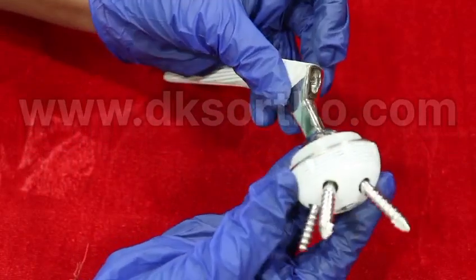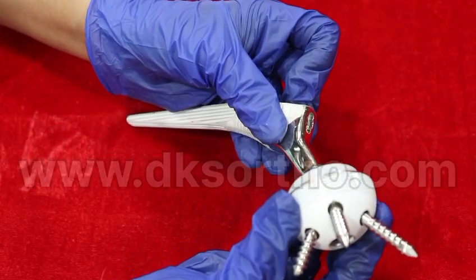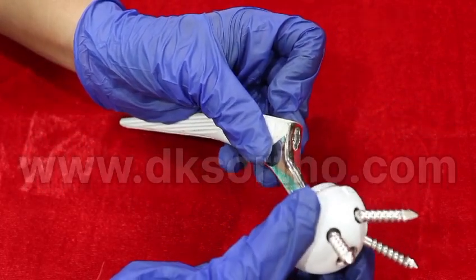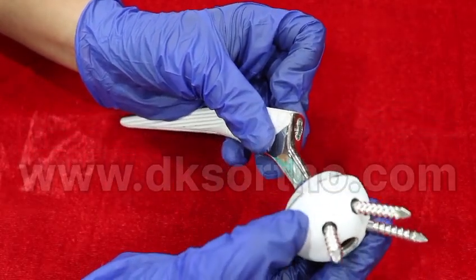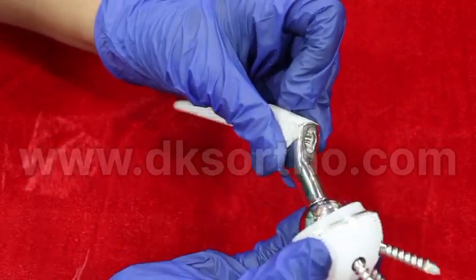This is the total hip replacement system, uncemented. The acetabular cup is available from 40 mm to 64 mm size, in both stainless steel and titanium. It provides 165 degrees of head coverage.